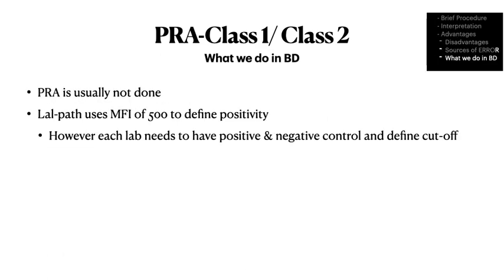Okay, so PRA class 1, class 2, what do we do in Bangladesh? PRA, I've not seen it being done commonly. Again, this is a very critical test and it has to be done. LALPATH uses an MFI of 500 to define positivity, but each lab needs to have their own positive and negative control. Based on that, they have to define cutoffs.